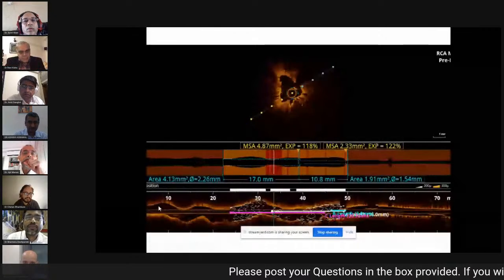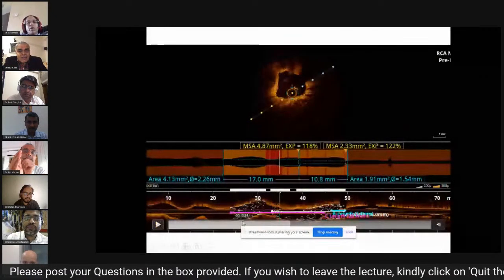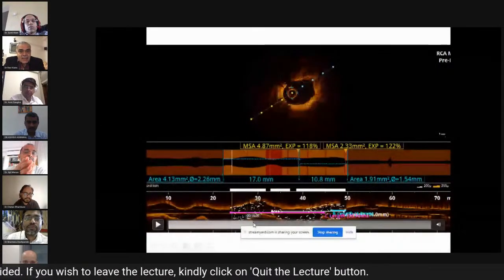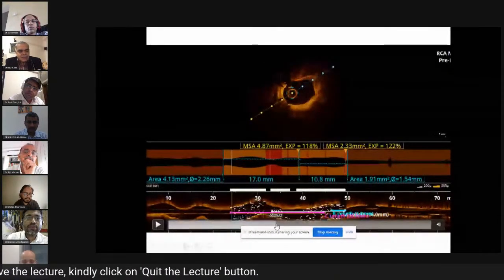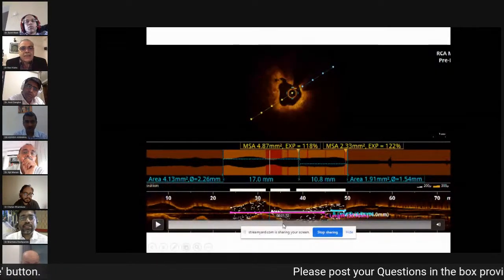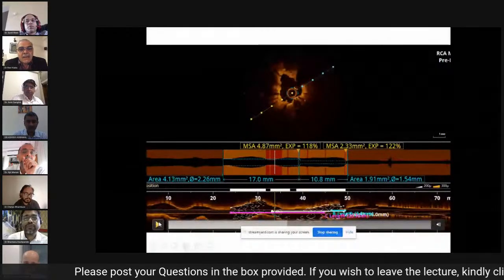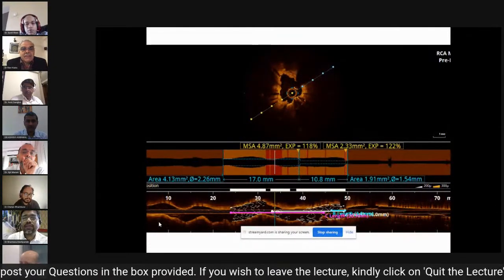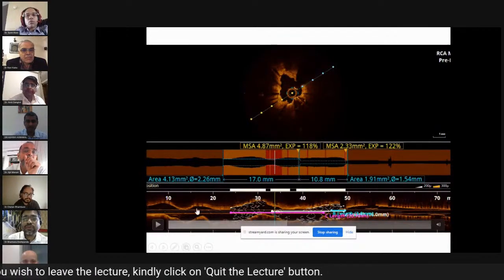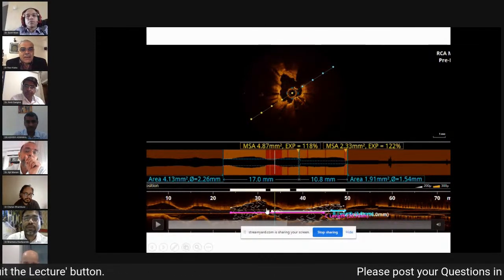Yeah. See, in this, you can see that there's no stent in this segment, and there's a significant amount of calcium all around. It's almost 360 degrees of calcium, and it's quite a thick bed of calcium. And I think you can see the cut. This is after the IVL, right? So you can see a significant amount of fractures in the calcium.